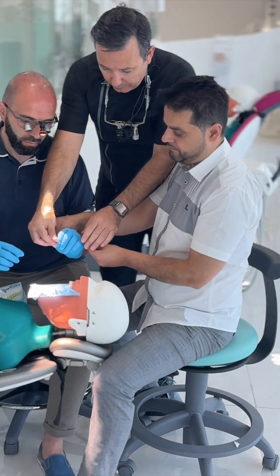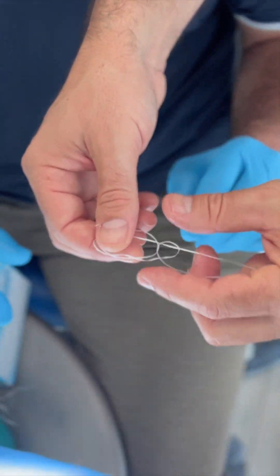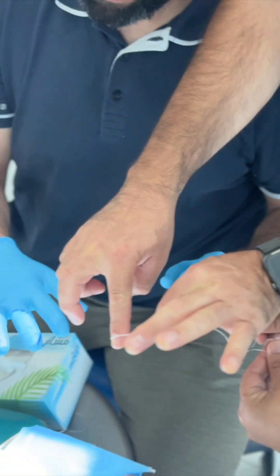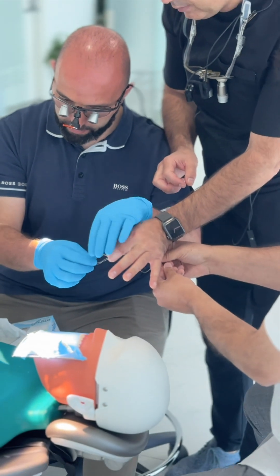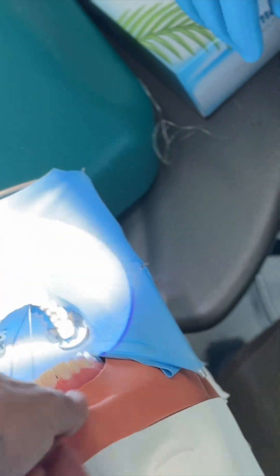Let's start from the beginning. The lingual — but it's on the mesiolingual. It has to be in the middle, so do this with the floss and move it.